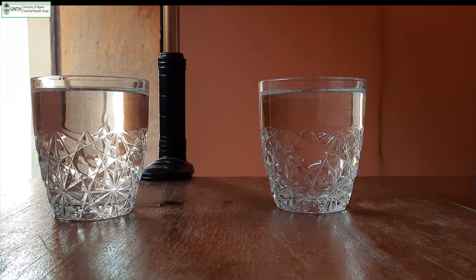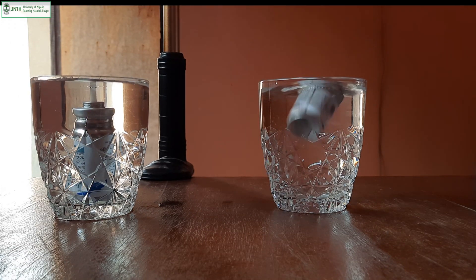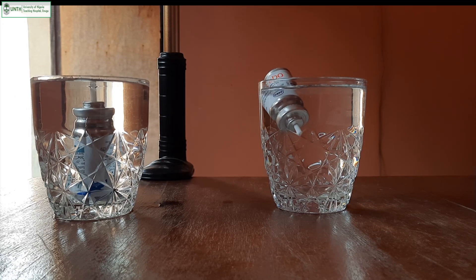Some pressurized metered dose inhalers you buy might not come with a counter, so you need to know how much medication is left after using it. For this you just need a cup with some water. A canister that's almost full will sink straight to the bottom of the glass tumbler, whereas an empty one floats above. That's how you can tell how much of your medication is left.